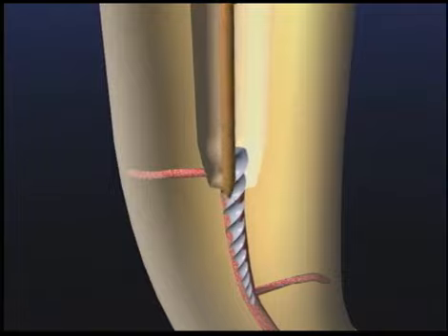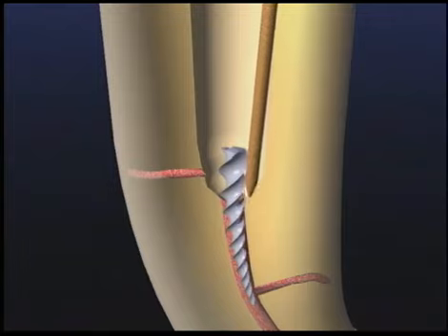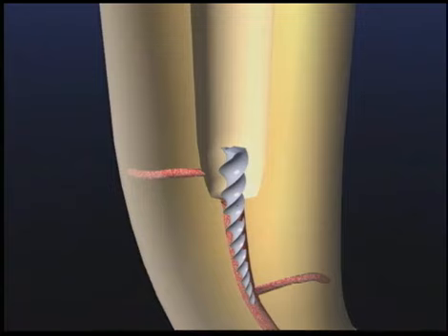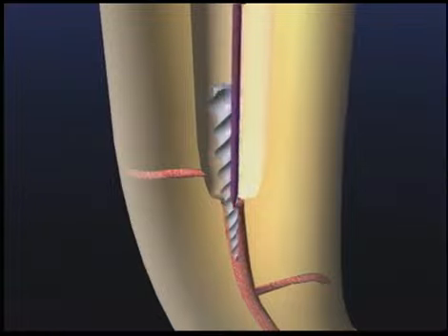You'll notice the zirconium nitride coating allows us to sand away minute amounts of dentin as we gently and progressively expose more of the file. As we progress deeper into the canal, a longer length and smaller diameter titanium instrument may be necessary to work safely. In my experience, if we can free up about 1/3 of the separated instrument's overall length, it will begin to loosen, unwind, and usually jump out of the canal.